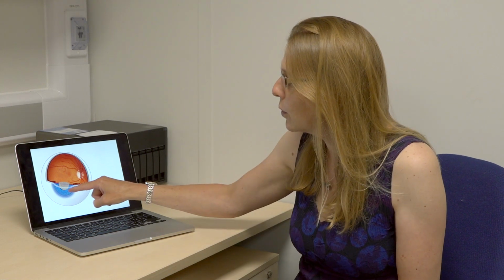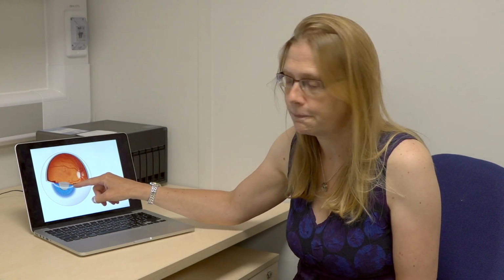That introduces a few challenges. So even for an observer who's got perfect eyesight, the optical quality of these components is not perfect. And secondly, if we ask our participants to try to keep their eyes still, it's not possible to do that. The eye always makes minute eye movements.